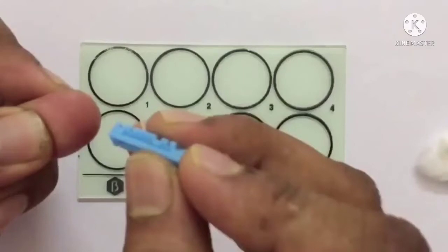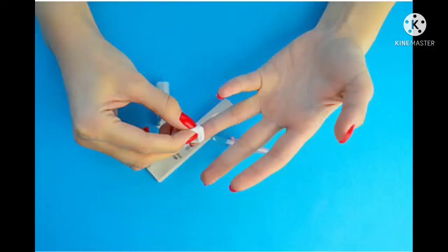Take a clean blood typing glass slide. Now wipe the finger with the alcohol swabs and rub gently near the fingertip where the blood sample will be collected.